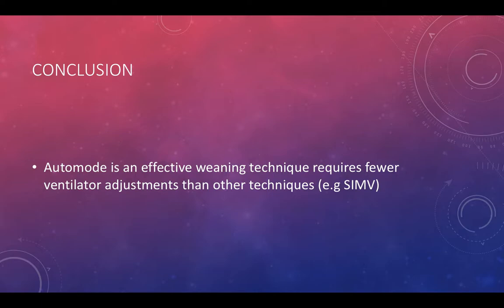Also, there is a study stating no evidence for Automode to speed up discontinuation from mechanical ventilation compared to other weaning modes. So Automode basically allows the patient to switch from mandatory breaths to supportive breaths and vice versa.